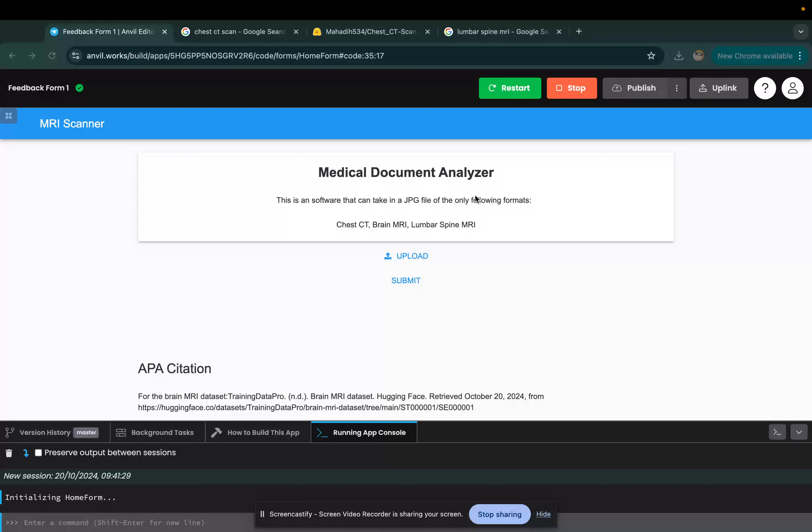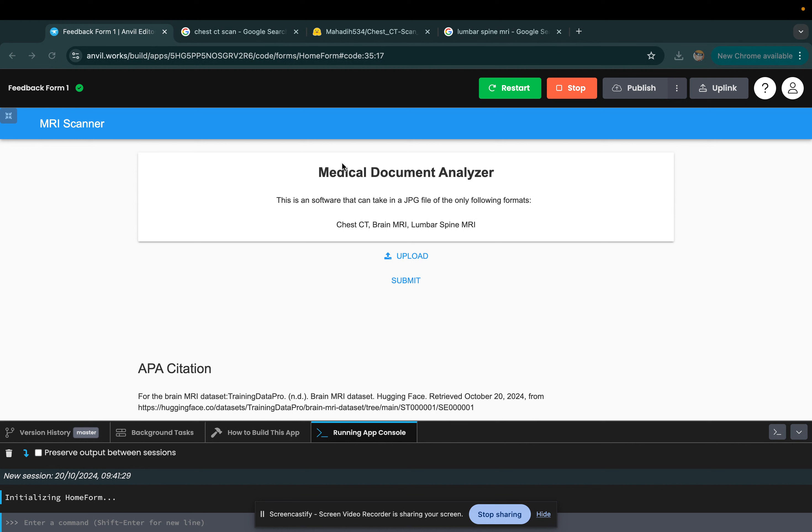Hi, my name is Hari and I'm Arnav, and we're Team Mamba. This is our medical document analyzer. It's a software that can take a JPG file of the following formats: if your patient has a recent chest CT, brain MRI, or lumbar spine MRI that we currently support, you can take it and we can diagnose you using our machine learning algorithms.